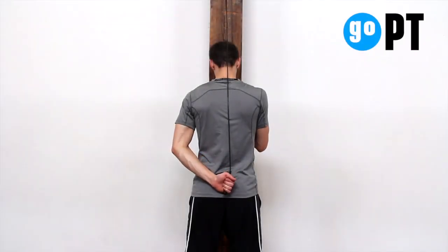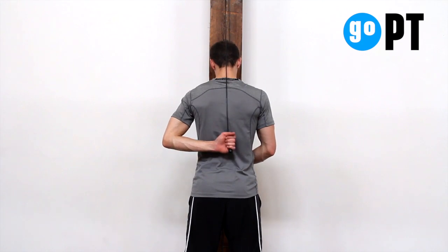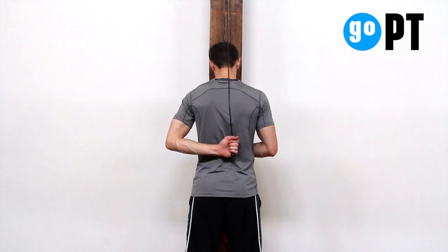Stand tall with one end of the pulley in each hand. Keep your unaffected arm in front of you while moving your affected arm behind you with your palm facing out.